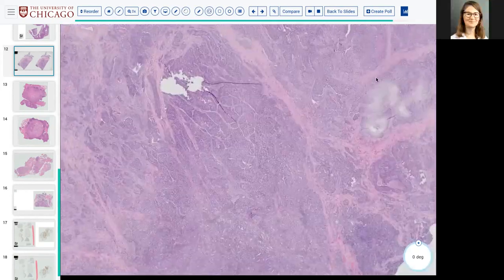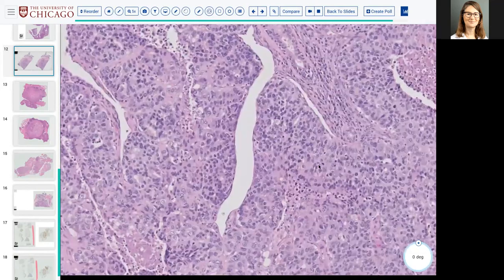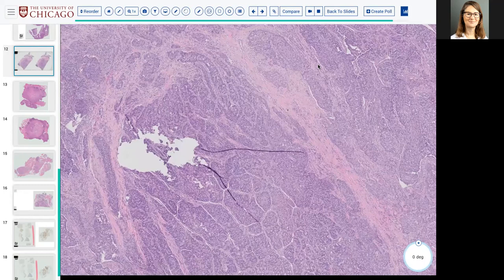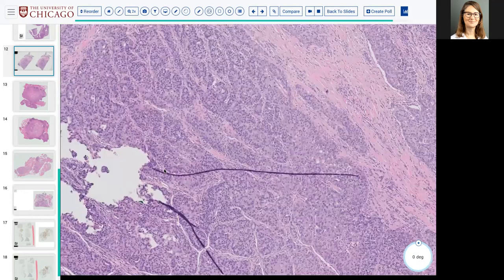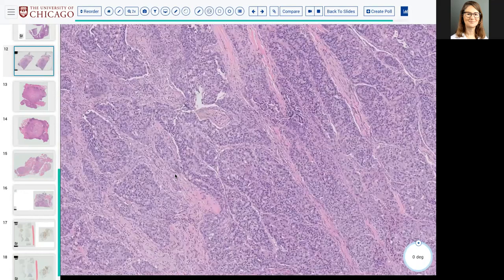Most important point: high-grade carcinoma. We've got that down. Again, high-grade carcinoma is high-grade carcinoma is high-grade carcinoma. And whether or not you see a pre-existing low-grade component, that's potentially okay, because they're going to treat this as a high-grade carcinoma regardless.